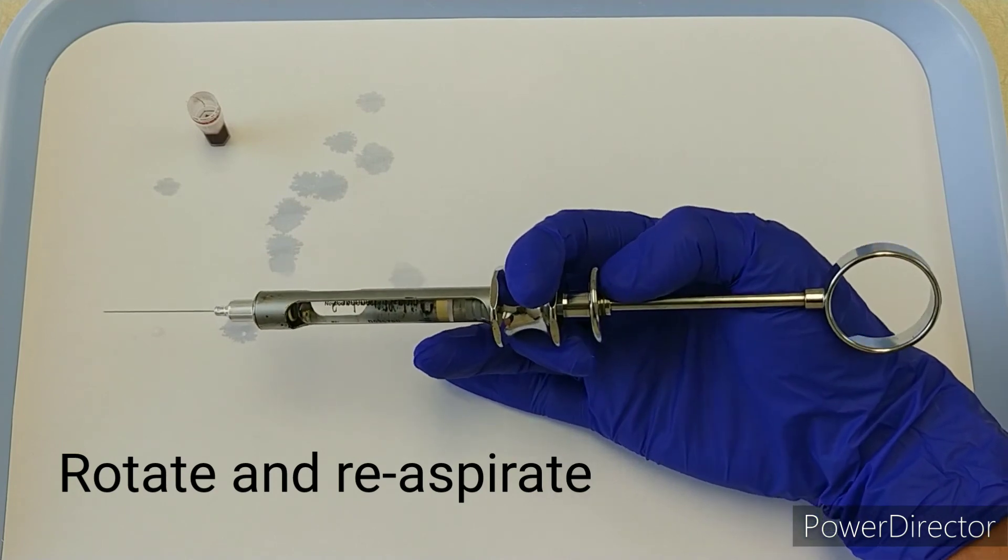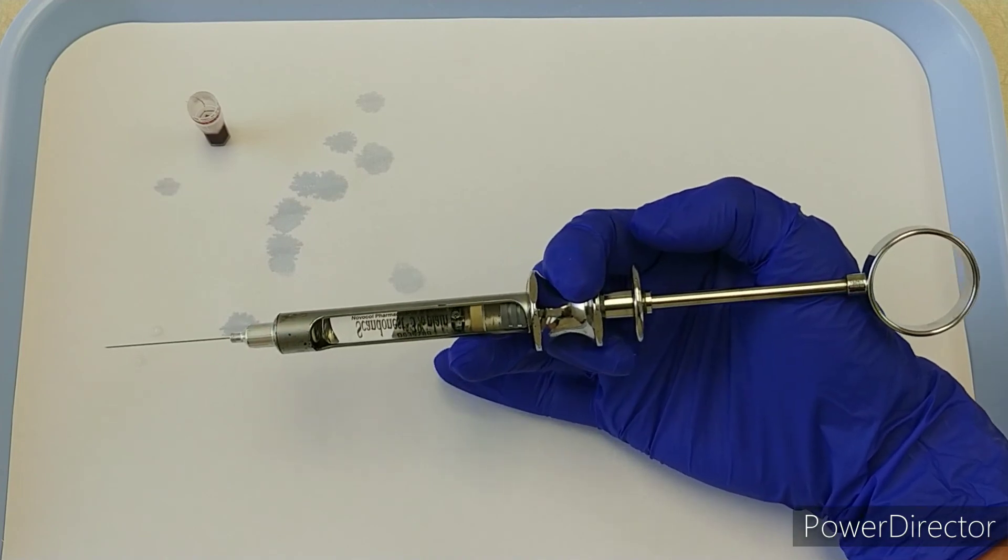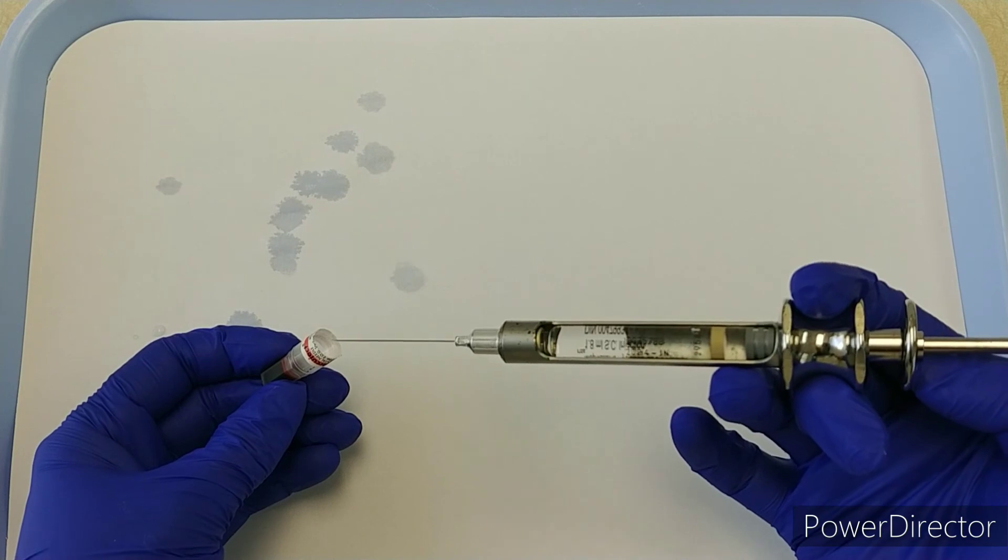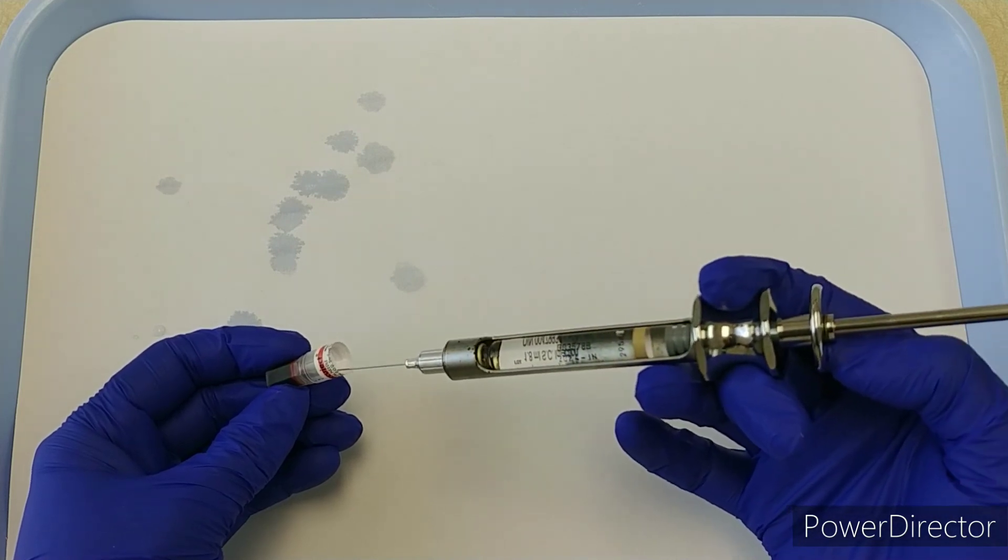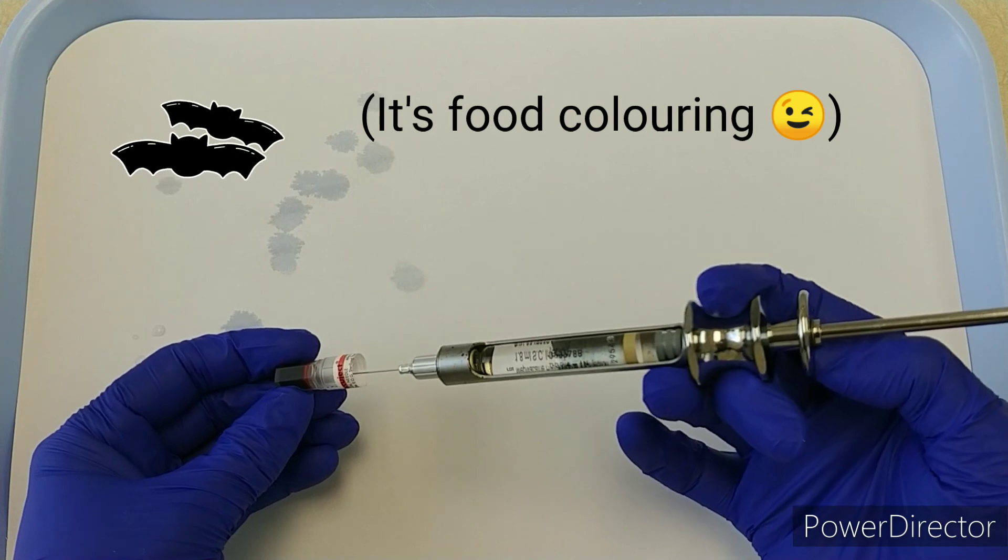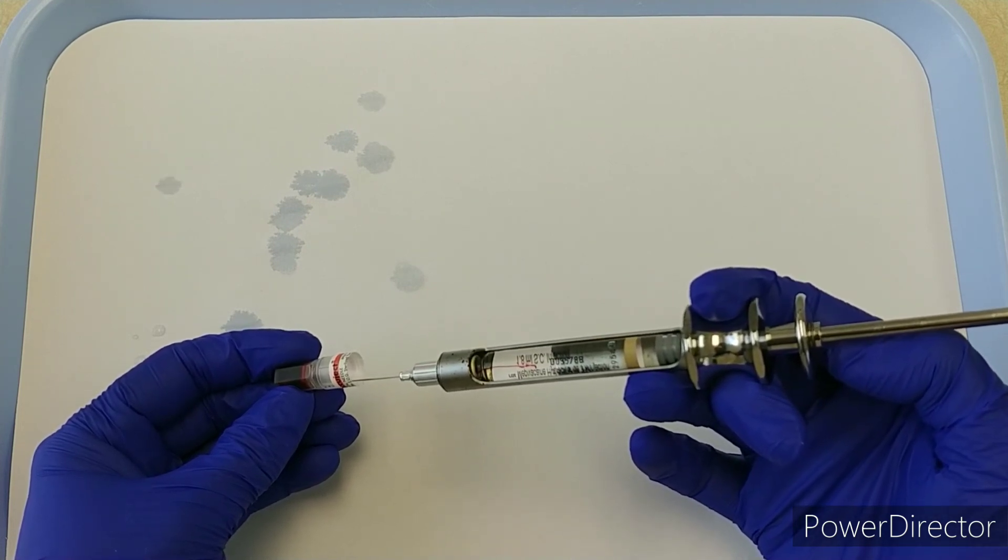If I'm going to get a positive aspiration with this self-aspirating syringe, I've got my little vial of blood there again. I'm going to push and you'll see how it goes into that cartridge.